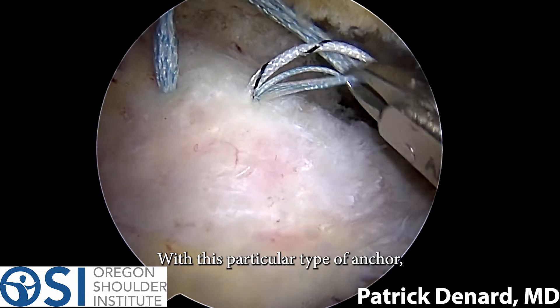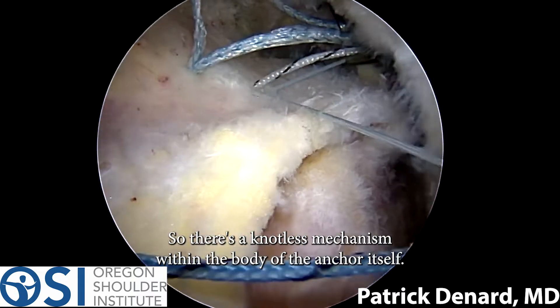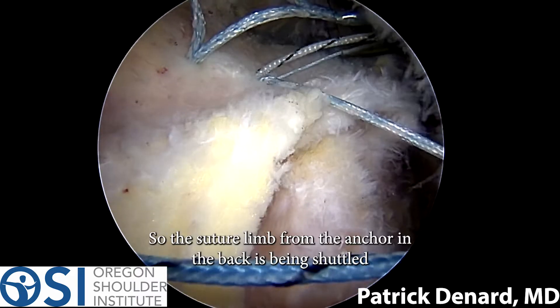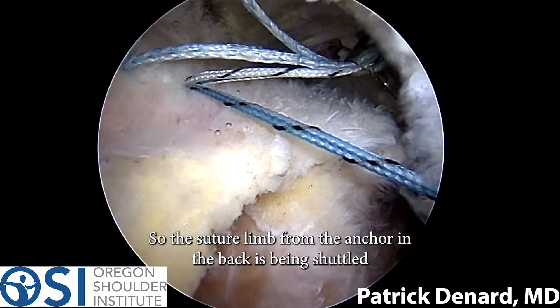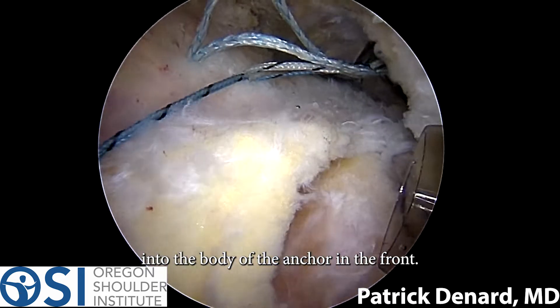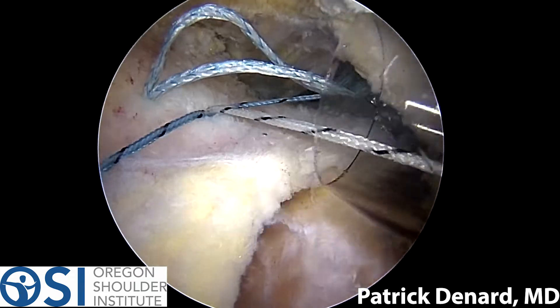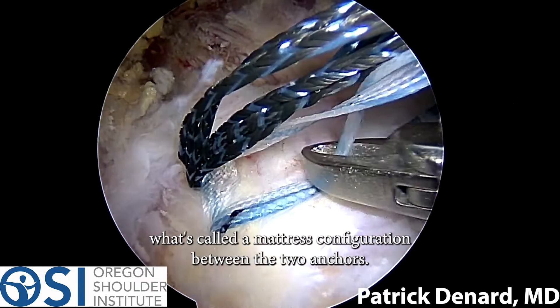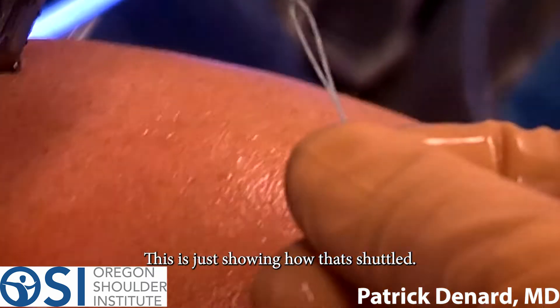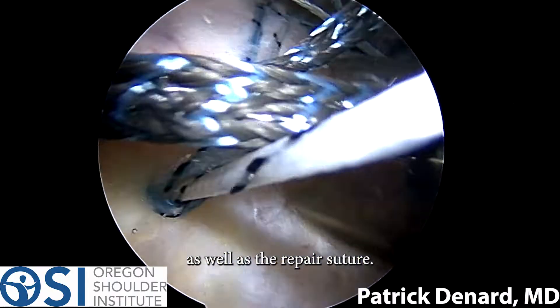With this particular type of anchor, I can link the constructs in a knotless mechanism. There's a knotless mechanism within the body of the anchor itself. The suture limb from the anchor in the back is being shuttled into the body of the anchor in the front. I'll repeat this process to create what's called a mattress configuration between the two anchors. This shows how that's shuttled, because there's a shuttling suture within each anchor as well as the repair suture.